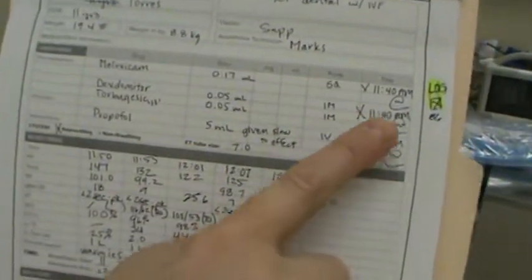So this is our complete anesthetic record. Up here in the corner denotes that we have logged our controlled substances, which are over here, which would be the Torbugesic that we used. So we did log that. And this record is complete, and that would be how you would use an anesthetic monitoring form during all stages of anesthesia in a surgical patient.